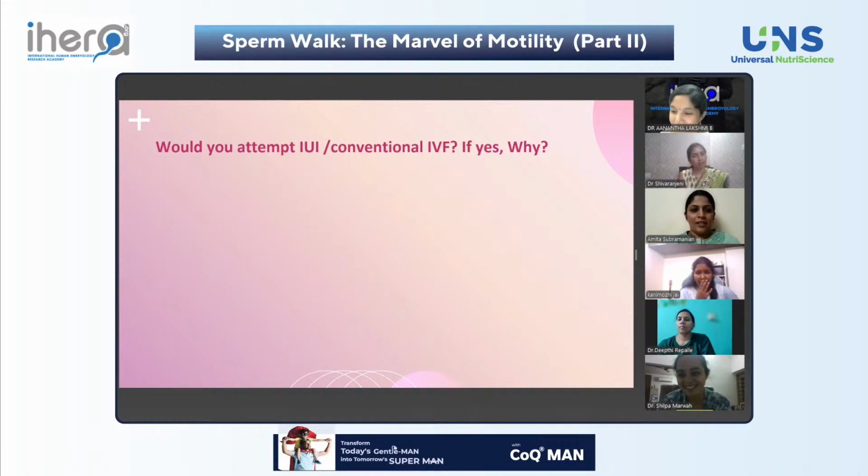And one more thing I would like to add. When we see the debris, whenever we are preparing the morphology slide, we need to train our juniors to see if they can see the bacteria, because whenever we are staining the spermatozoa, bacteria also get stained with the similar stain. It is not necessary that if a sample has some bacteria or fungus, it will grow in the culture test. I have seen many times I am able to see bacteria like streptococci or some other bacillus, but the culture report comes negative. So that is also there.